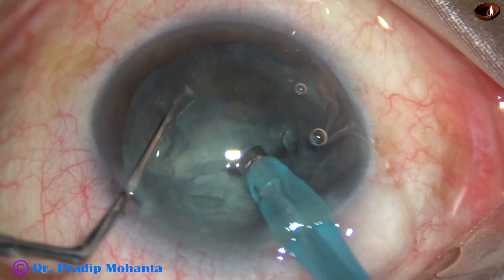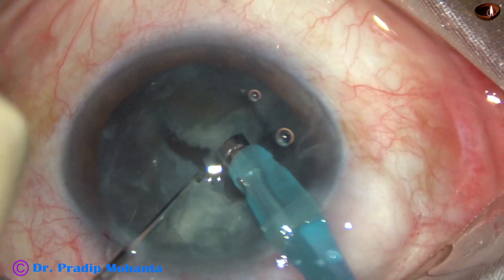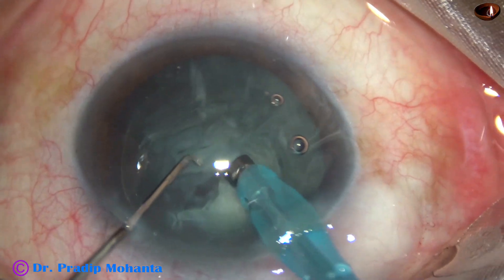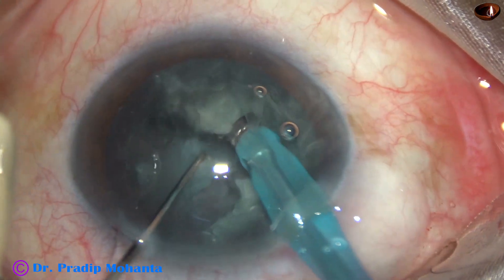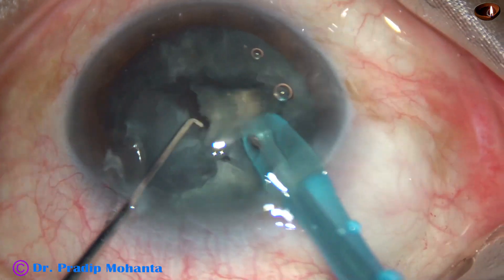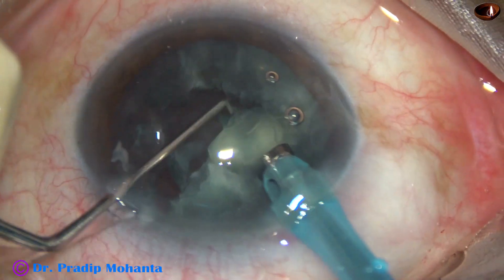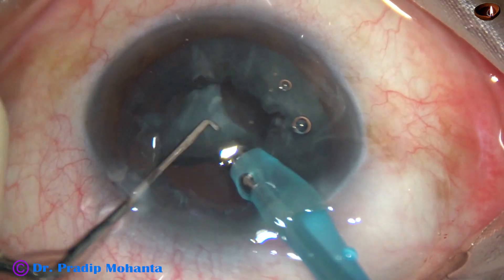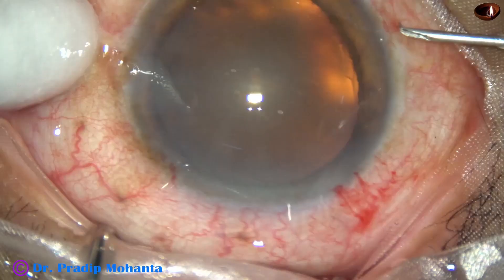As we support the lens mass, the chopper slices the nucleus. This is mechanical chop. If we try to hold the lens mass with vacuum, we will just eat up the lens matter in front. In such cases, ultrasonic energy required is very less. So this is a very nice technique.